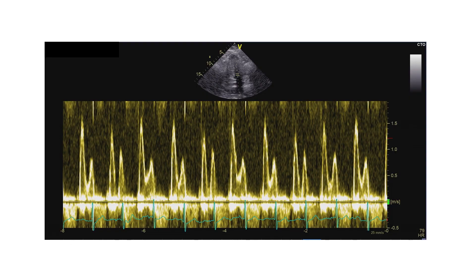Here we can clearly see that the patient has a very high E wave and a low A wave with a relatively steep deceleration time. This would point to the fact that the patient has diastolic dysfunction, probably a restrictive filling pattern with elevated filling pressures. We can take a look at that as well.